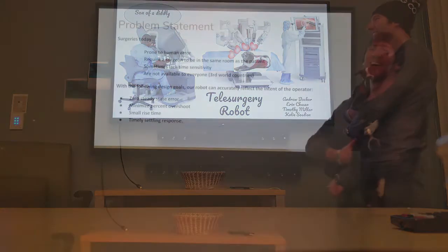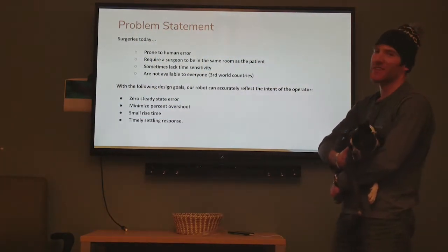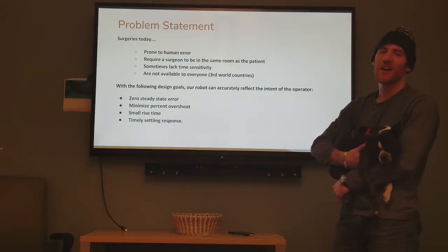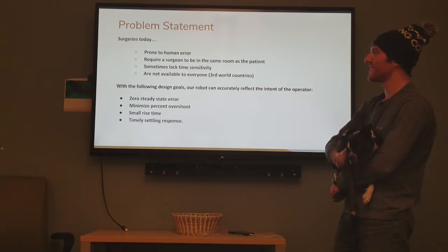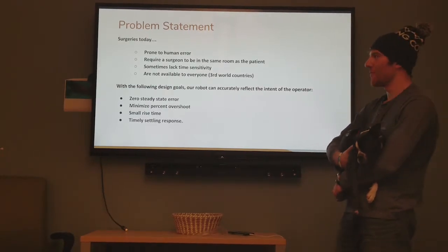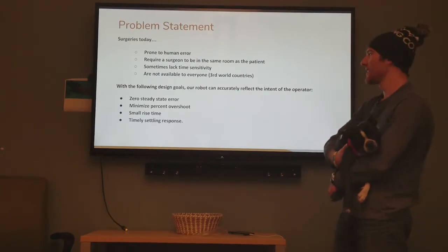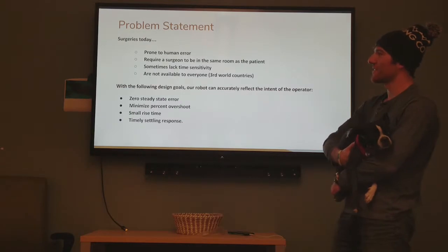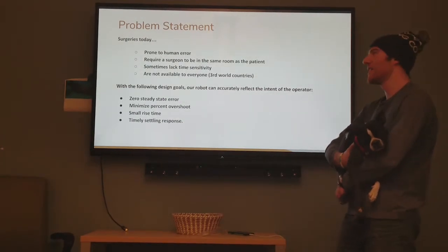Next slide. We chose to work on a telesurgery robot because we think there's a lot of things that can be improved with surgery right now. One of those things is human error from the surgeon. Another major benefit of having a robot do surgery is that it doesn't require a surgeon to be in the same room as the patient.